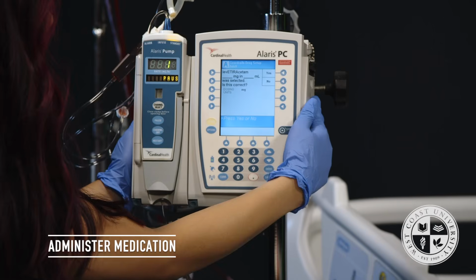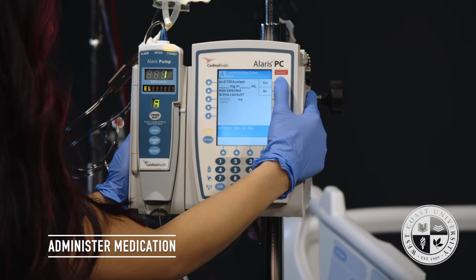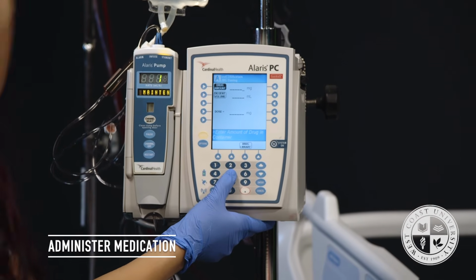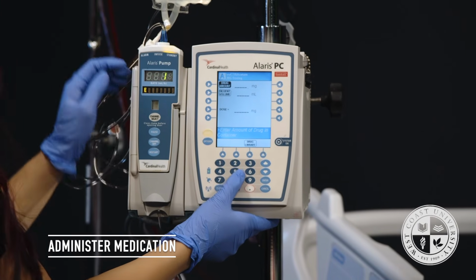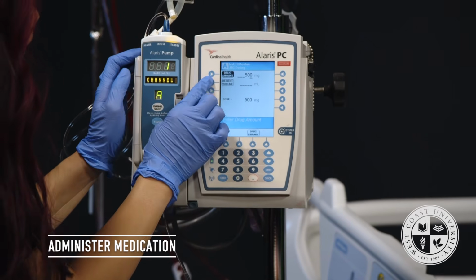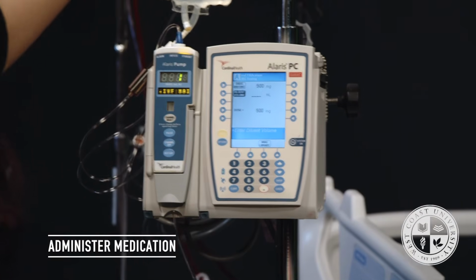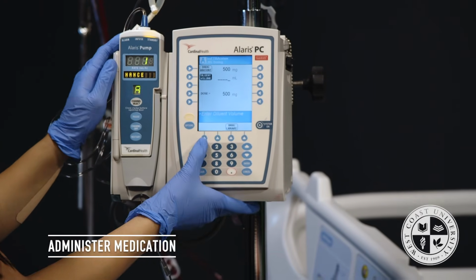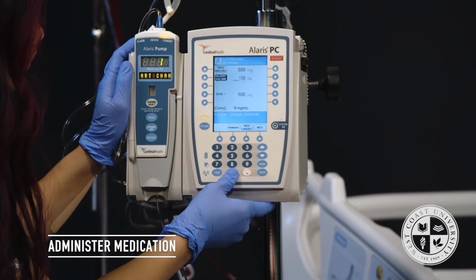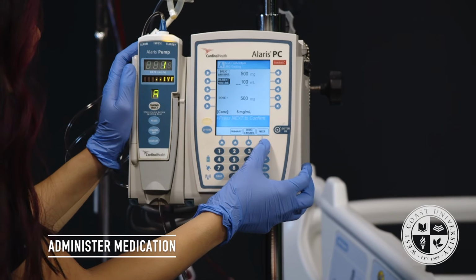It's asking me if I want to program it in milligrams within mLs, which I'm going to say yes. And I'm going to enter what is on my order that matches my IV medications label. So I'm going to enter 500. And it says here that it's a 100 milliliter bag. Within a 100 milliliter bag, everything matches. So I'm going to go ahead and enter that. I'm going to make sure everything is correct. I'm going to hit next.